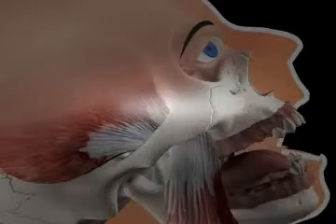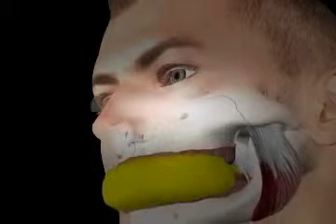During the bite analysis procedure, a silicone squeezer is placed between the two toothless or sparsely toothed jaws. Based on the impressions of the jaw ridges in the squeezers, the technician can now roughly position the plaster models and prepare what is known as a bite splint. With the aid of the bite splint, a second bite analysis is performed, during which the patient wears the bite splint instead of the squeezer. Thus, the determination of the jaw position is even more accurate.